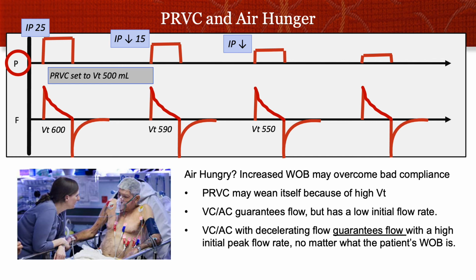I flipped to volume control, and I watched the patient fall asleep in front of me. Their troponin came down, and they did not have to go back to the cath lab. And I felt pretty cool that by understanding ventilators, I could help somebody not get another invasive procedure.